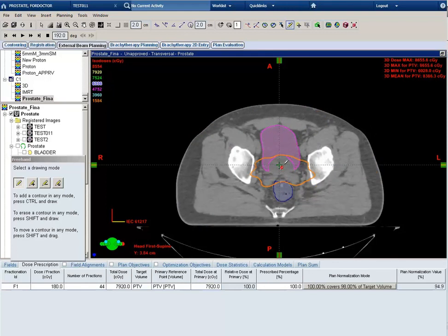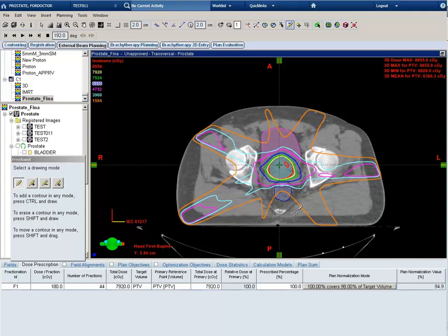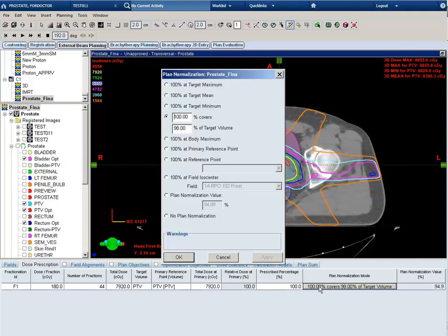I'll use the pencil tool to draw a small contour just superiorly to the true PTV. This will help improve our coverage superiorly.